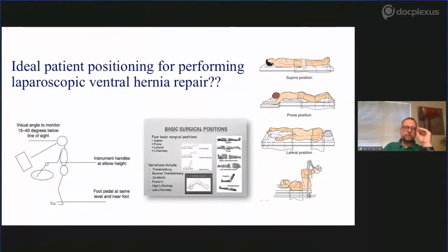This is very important for robotic repair because you have less collision. And this is a very interesting point that you raise. I have one patient who developed leg pain, and the patient had prior spine problems. So now I really look after those patients with prior back problems or spine surgery, and I'm more conservative with this flex.